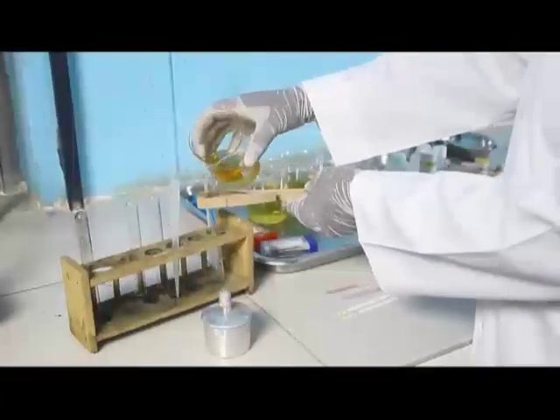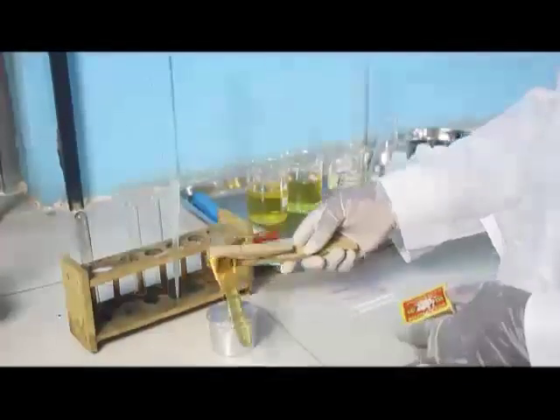Boiling test. A test tube is partly filled with urine, held at the lower end, and the top inch is boiled.